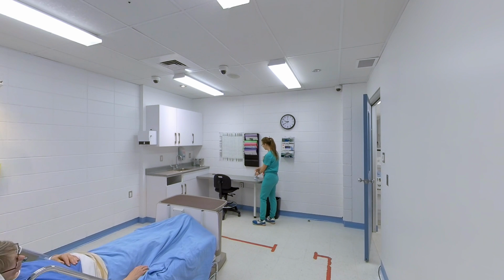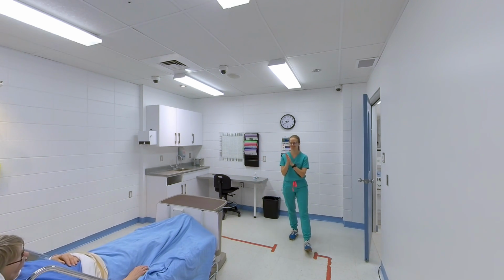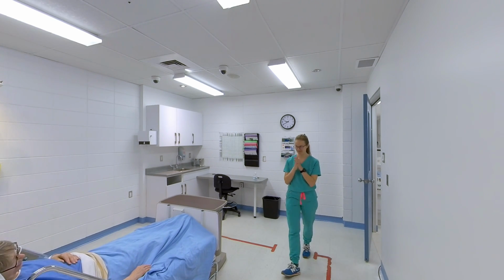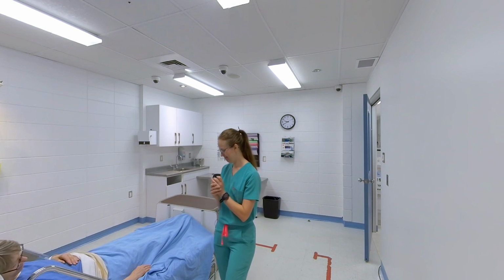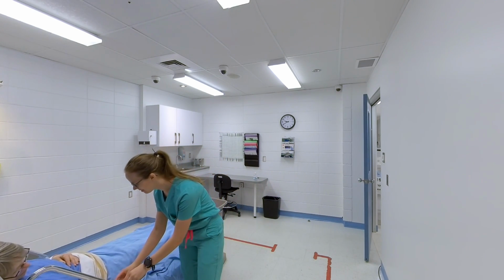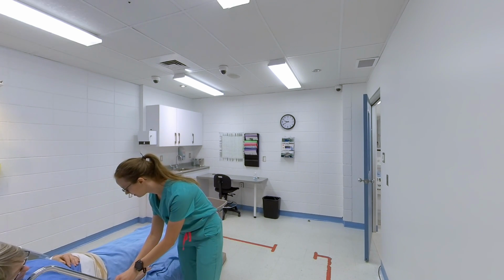The pre-procedure steps will be performed by the PSW and nurse. She will disconnect the IV from the pump to change the user's gown and will reconnect it once she has been changed. While doing so, she will equally check the IV site for anomalies.